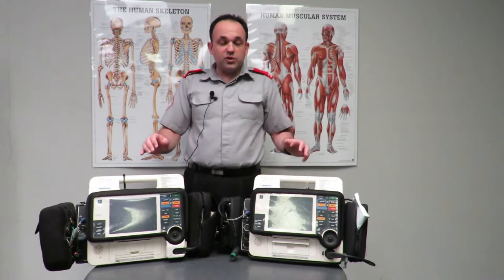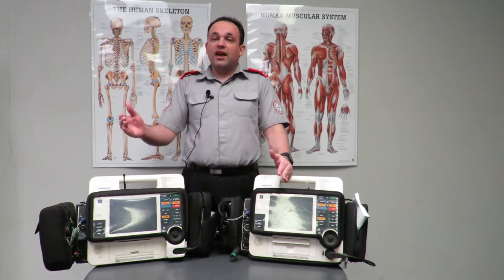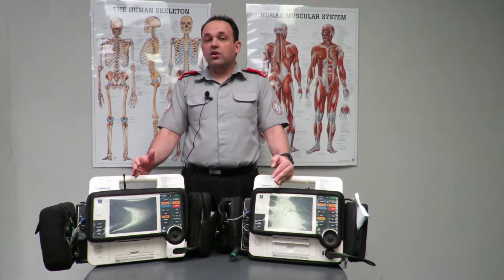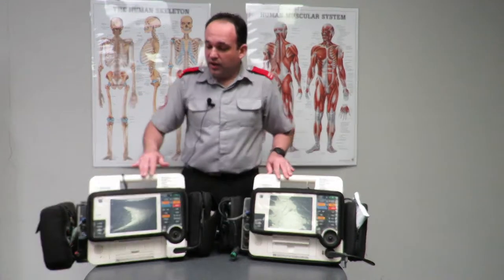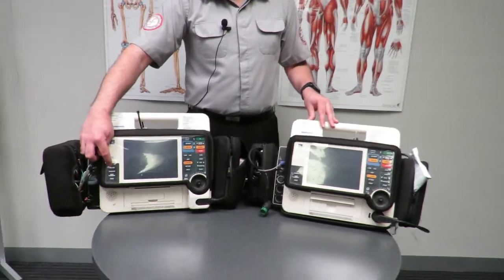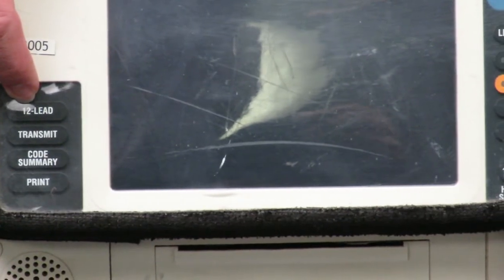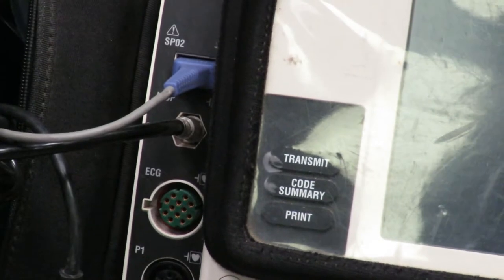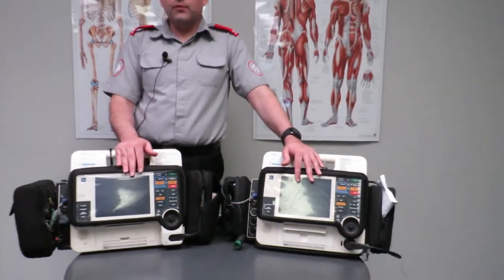We'll start with the differences between the units. On your right is a 3-lead unit and on your left is a 12-lead unit. The way to tell the difference just by looking at them is that the 12-lead unit has an additional button at the bottom left corner which simply says '12 lead.' If the unit doesn't say that, it's not a 12-lead unit. Both setups are exactly the same and you'll find equipment at exactly the same locations on both units.